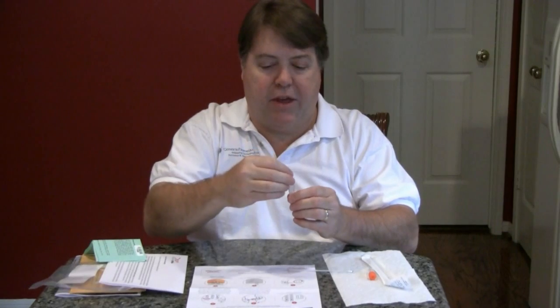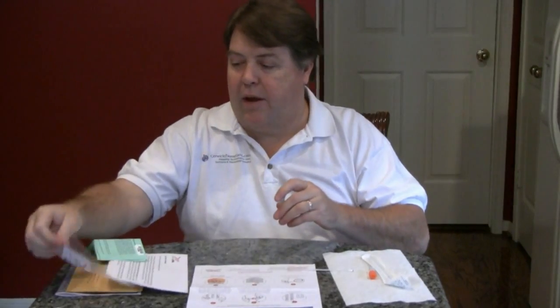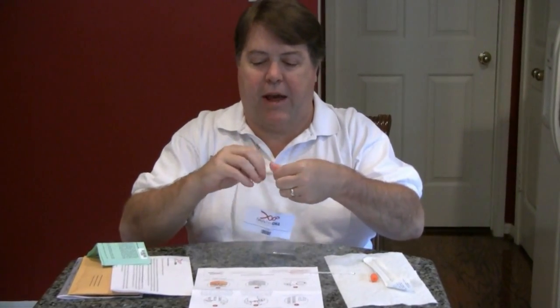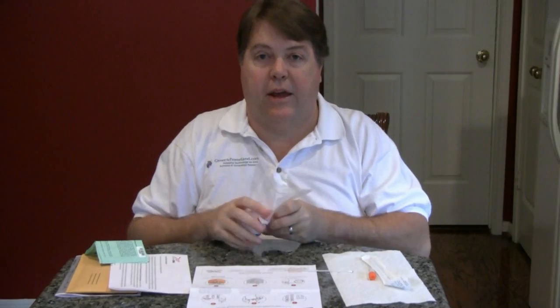Then I'm going to replace the cap, screw it down, give it just a little shake to coat it in the preservative, and put it in my bag to send to the lab. Be sure that the lid is closed good — you don't want the sample to leak in the mail.